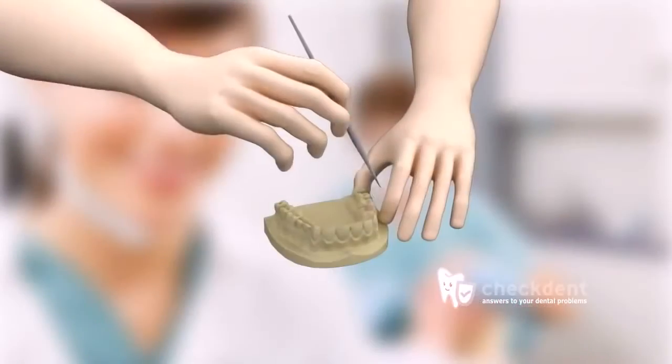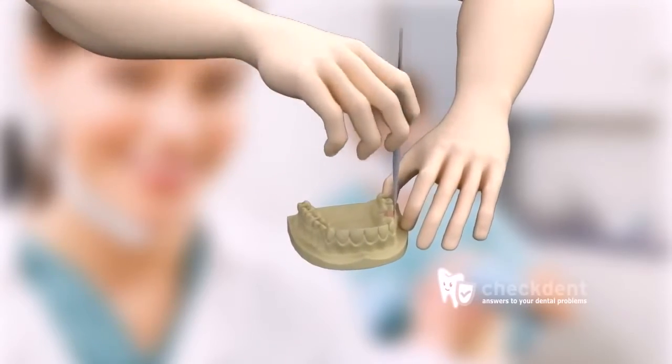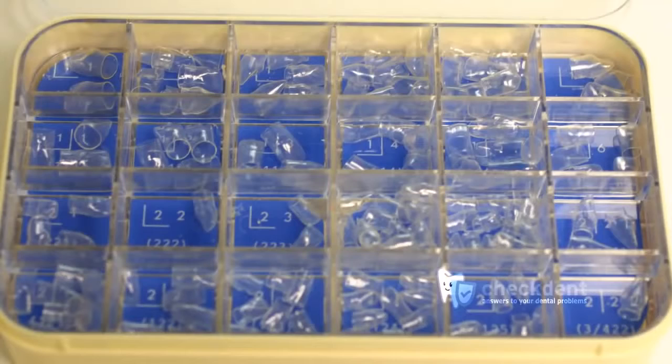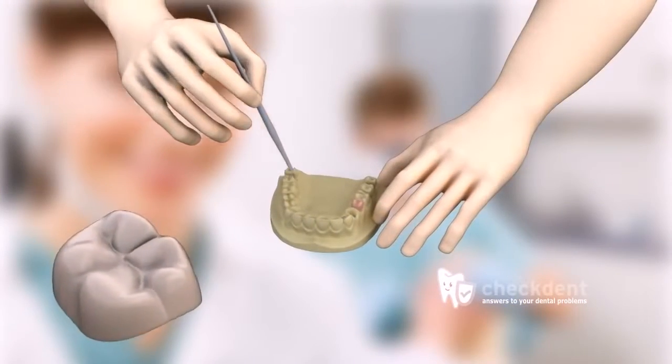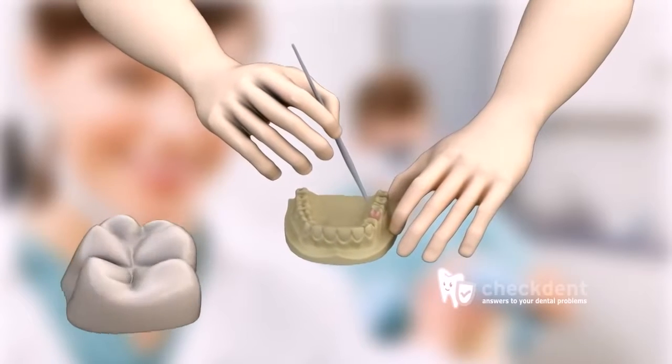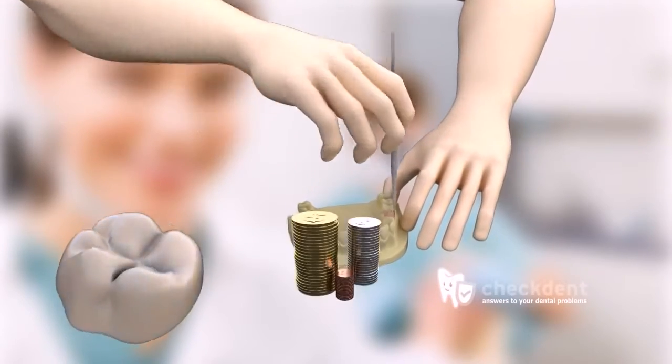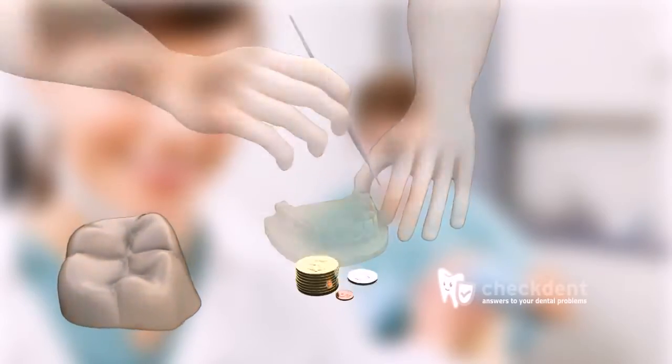Not every technician can master this technique. Recreating a beautiful crown is an art. The crowns in the other picture have been made out of a prefabricated shell, and they have been painted according to the color indicated by the dentist. The technician never saw the patient. This is quick and less time-consuming, and so costs less money.